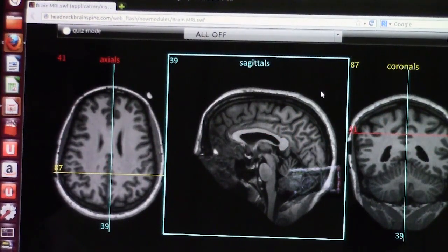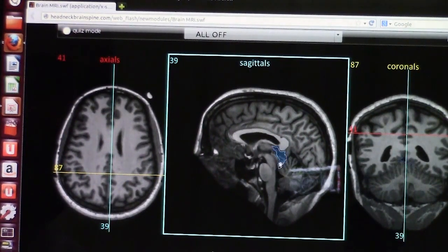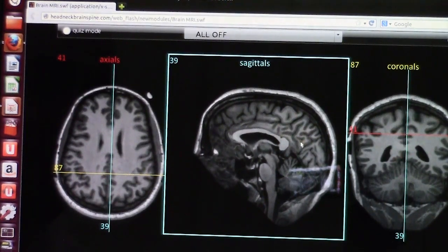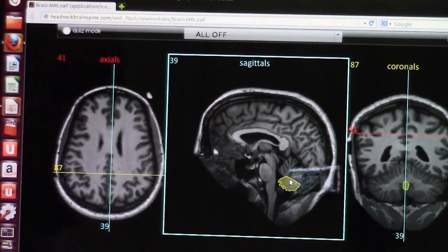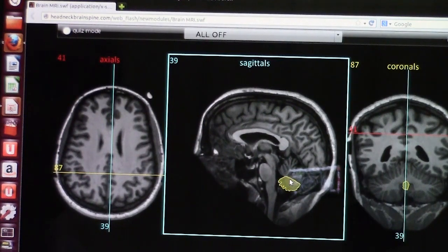Another key structure to look at on the sagittal T1 is the vermis of the cerebellum. You need to look if it is absent or present, and also whether it is normal or atrophic, especially in children's brains and in adults. Here you see the anterior cerebellar lobe and the posterior cerebellar lobe, and here you see the vermis.